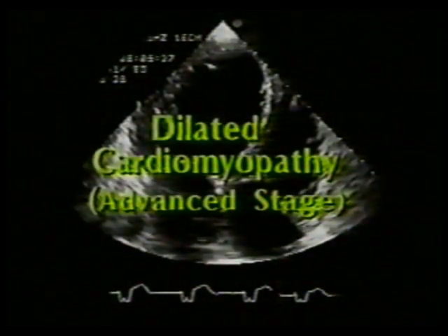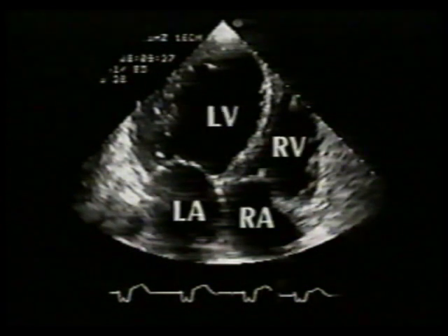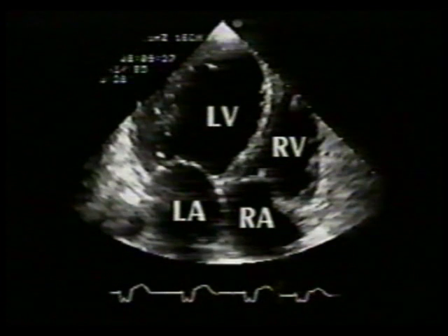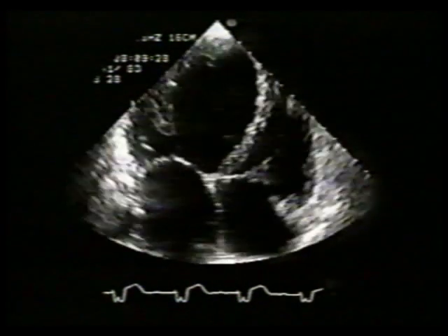This 56-year-old male has enlargement of both ventricles. In real time, you will see that both left and right ventricular systolic function are severely depressed. His ejection fraction was 14%.